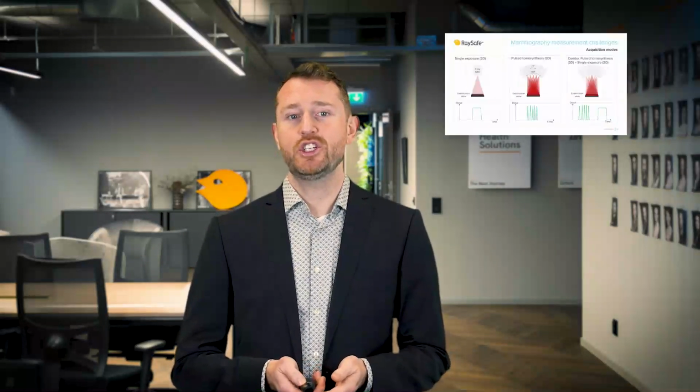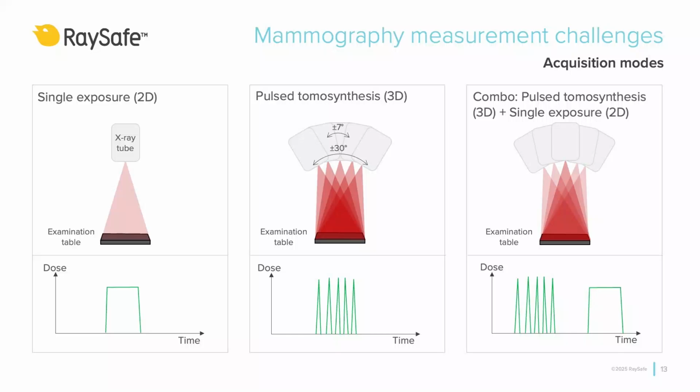The most common acquisition mode during screening is still regular 2D imaging. One exposure results in a high-resolution 2D image. There is also a mode called tomosynthesis, in which the tube sweeps over the breast while several images are taken at different angles to build a 3D image of the breast.